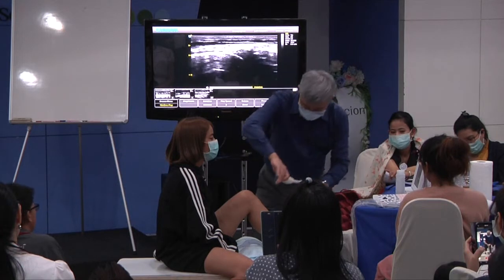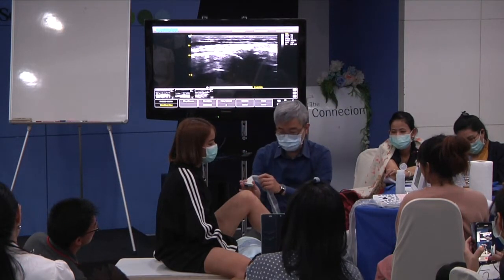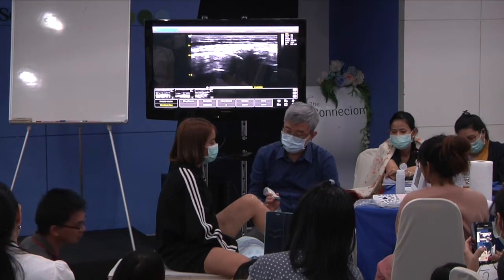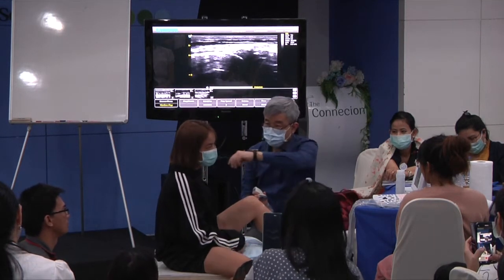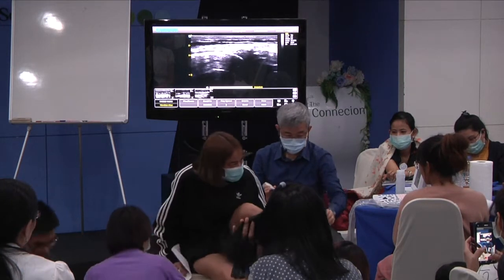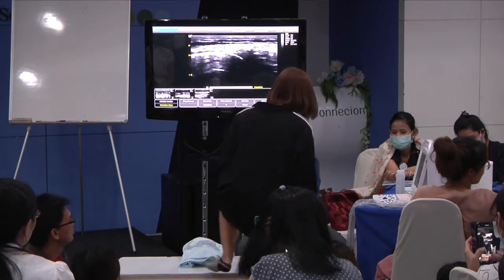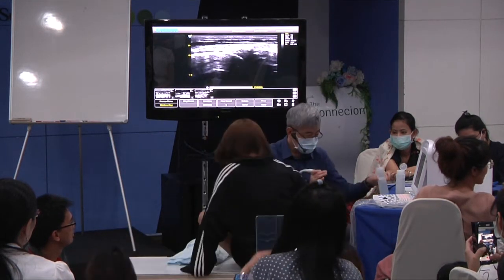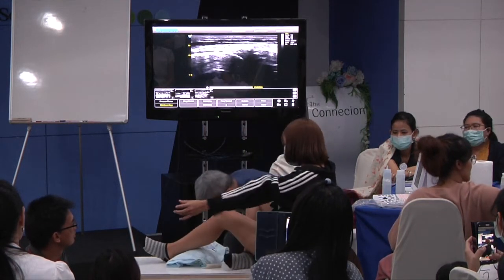Now we are going to the next step of our presentation: the lateral knee. Can you sit in here and face the screen? So they can see my probe.